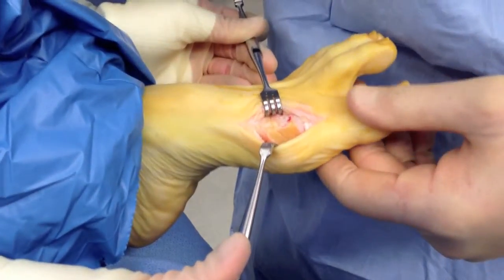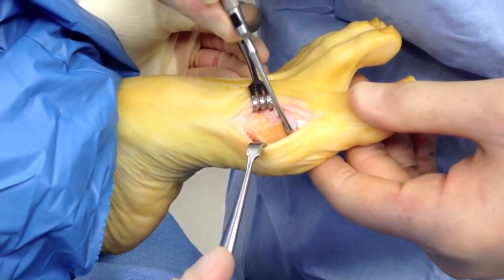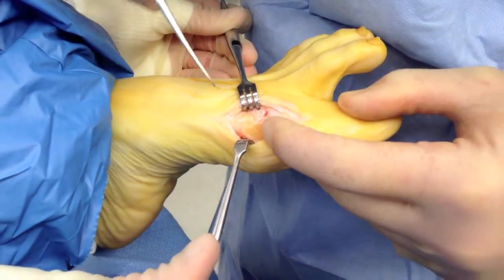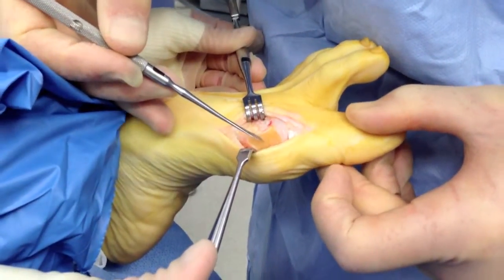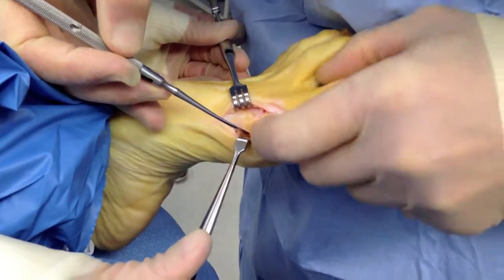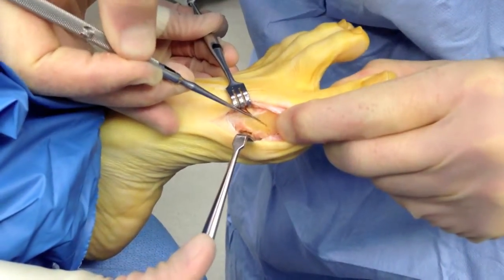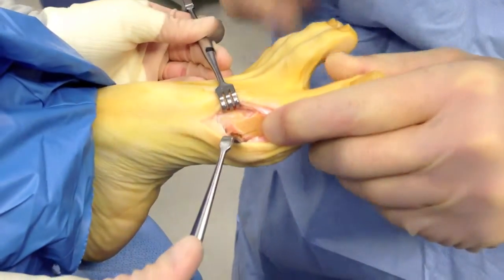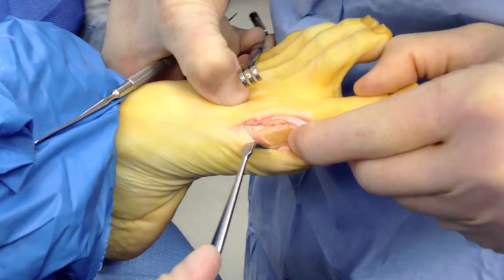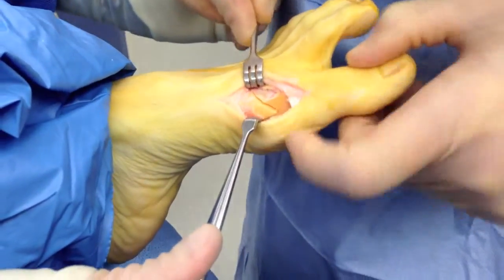Now we have the chevron cut made on the side here after the medial eminence or bunion bone was removed. The V-osteotomy was made with a saw, and the dorsal and plantar arm is as follows — you can see when I pull it open how it gaps open. What we're going to do now is shift the head over, and this is how we correct the bunion deformity, where we actually shift and move the head over about that much.